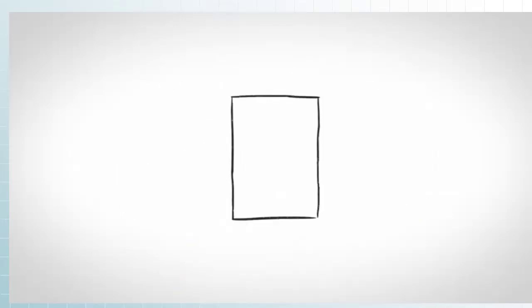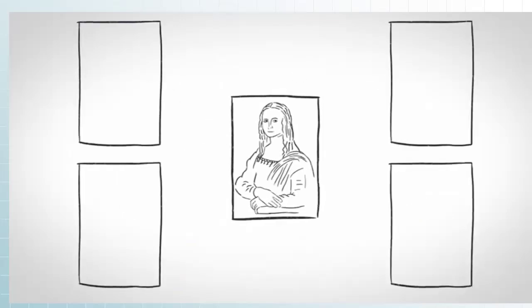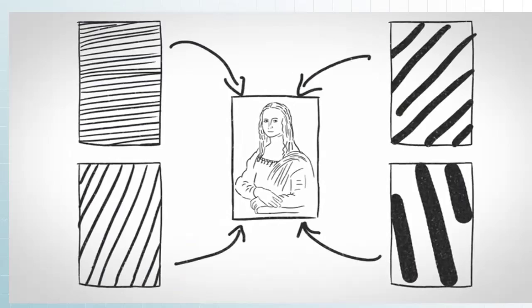To understand why, we have to first understand that these images are actually just made up of waves. I found this really cool simulation on MATLAB. You can see how this image is being split up into a set of black and white single waves like this, each with its own frequency. Splitting up an image or a signal into its constituent frequencies like this is called a Fourier transform. The Fourier transform is a super important mathematical function that pops up almost everywhere in physics and engineering.